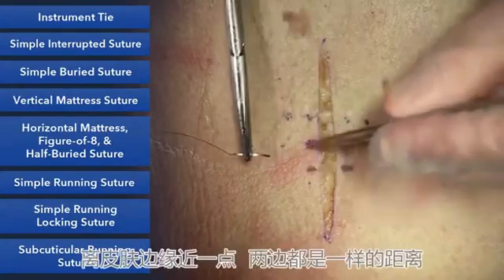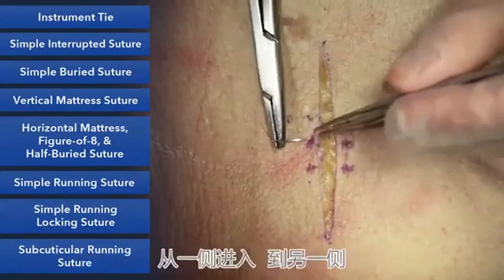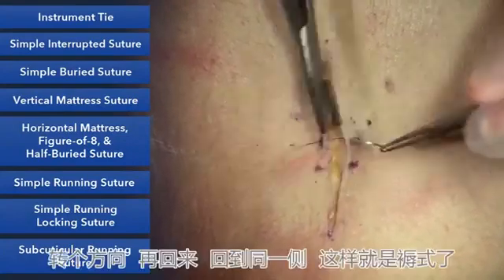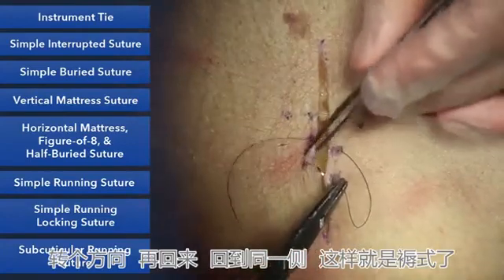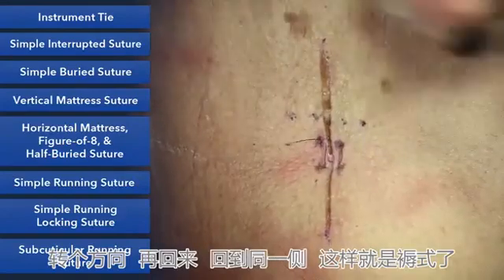It's important here that you stay close to the skin edge and that you're the same distance on both sides. You'll take your bite on one side, and then the other side, and then you'll turn it around, and you'll go back, so you'll end up on the same side. And there you can see our mattress.